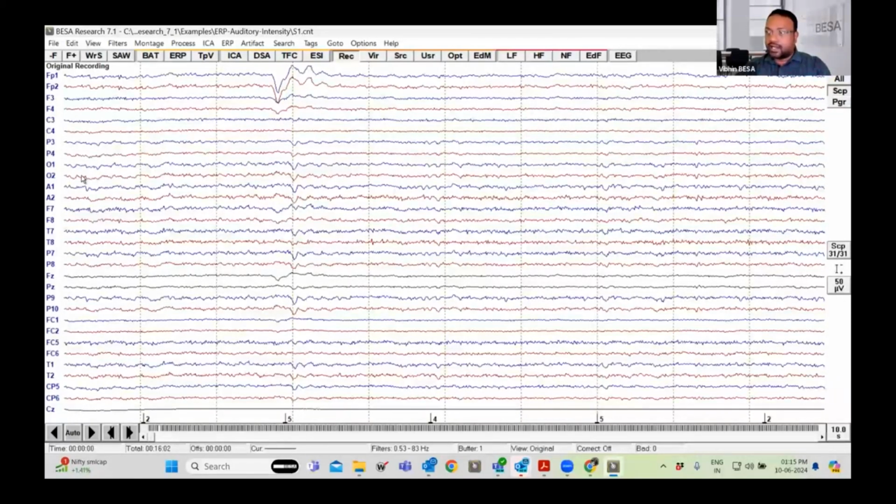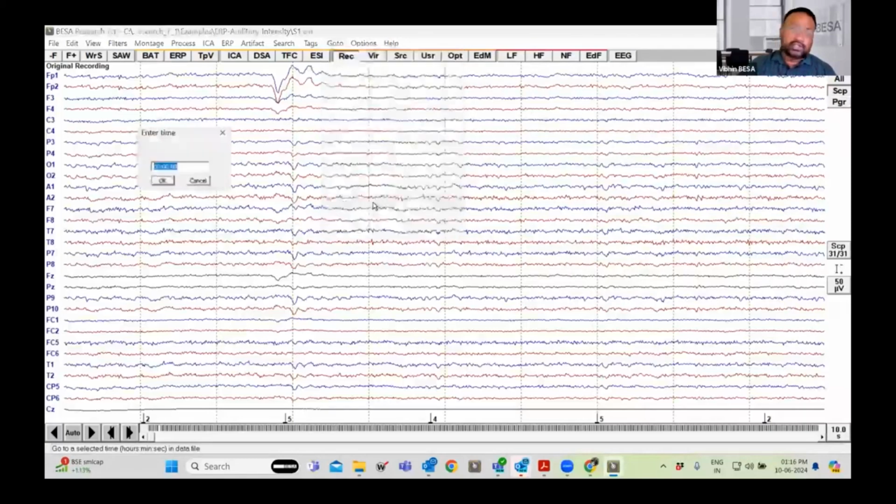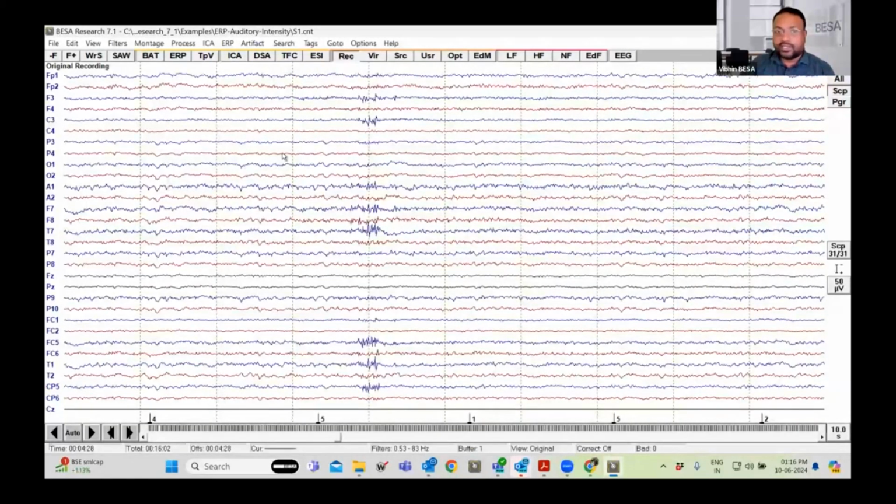Next, we need to go to a certain time, which I showed you some time earlier. You can click Go to, and you can choose the time. Let us go to the time 4 minutes and 28 seconds, because you might see something there. So here we see some kind of activity, and based on the frequency and the pattern, it looks like a muscle artifact. It is a muscle artifact.